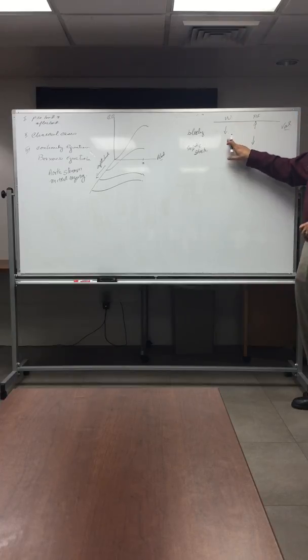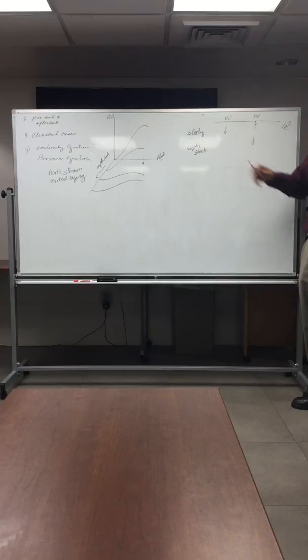What do you expect the wedge to be? High. Why do you expect it to be high? Because I figured they worked opposite. Not necessarily. Okay, let's reason this out together. You have a vasodilatory effect. Everything is open. What happens with the blood return to the heart when you open up all the vessels?